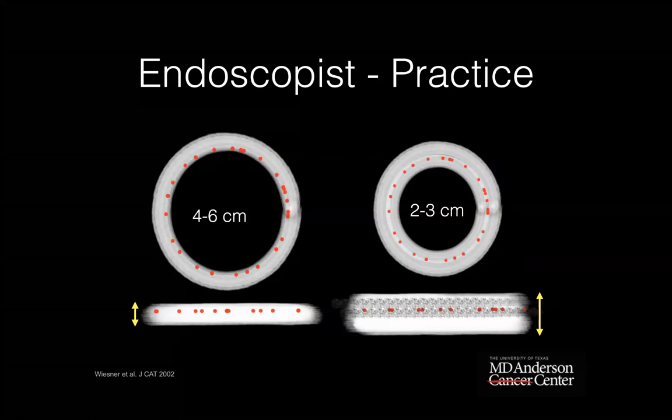On the other hand, if you decompress the colon before you cut and make the colon wall a little bit thicker, then you may not get into trouble. So what I typically do is, before COVID, I used to open the cap on the biopsy port to vent out all the gas so that the colon gets decompressed, and then put the cap back and get my snare in. With COVID, you never know, you don't want to have any spills. I stopped doing it. I just use suction to decompress.